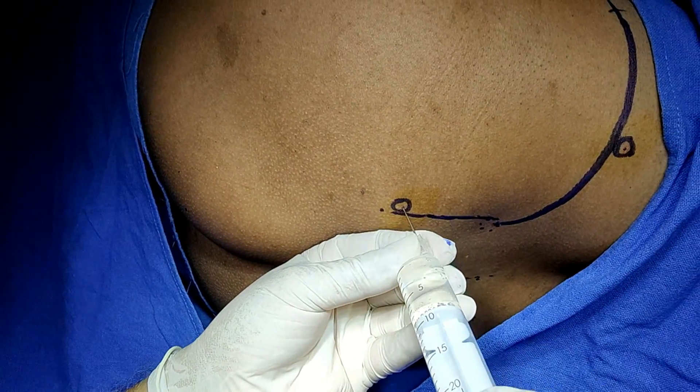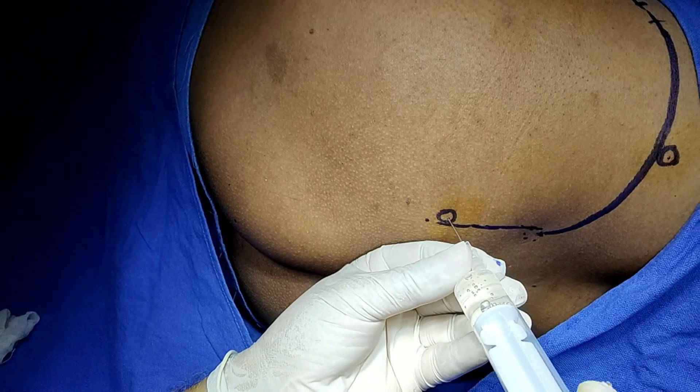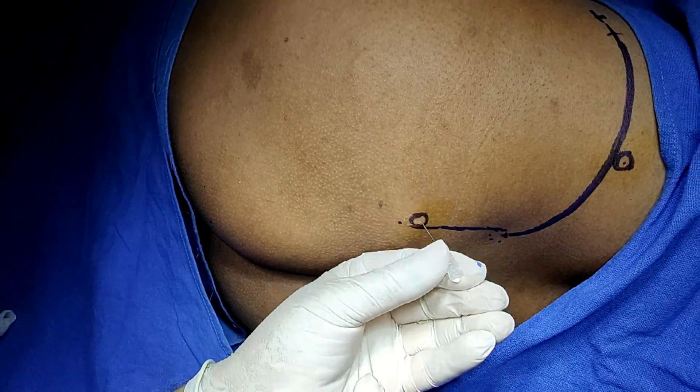Aspirate again to avoid any accidental intravascular injection. This block is now complete — check for spread of the solution.